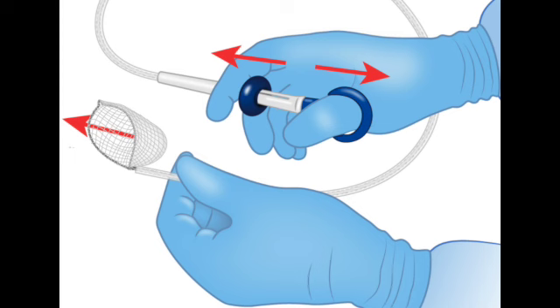Oh, absolutely. And this is where teamwork becomes non-negotiable. The source material, Dr. Raju's video, really emphasizes this. You absolutely cannot operate that net carelessly. The person handling the slider must work in sync with the endoscopist, the one who actually has the camera view. Why? Because when that net opens, the wire frame is exposed. If you're not careful, if you open or close it without clear visual confirmation, you could snag the colon wall. Precisely. You could capture and actually rip the delicate lining, the mucosa of the colon. That's a serious complication you want to avoid at all costs. So clear view, careful coordination, it's vital. Okay, that makes total sense.